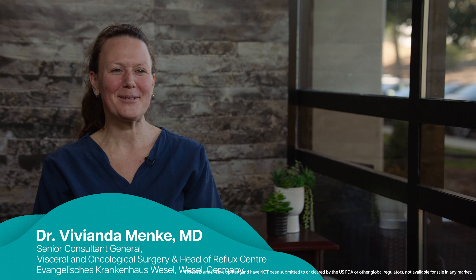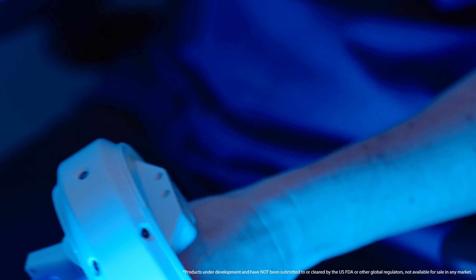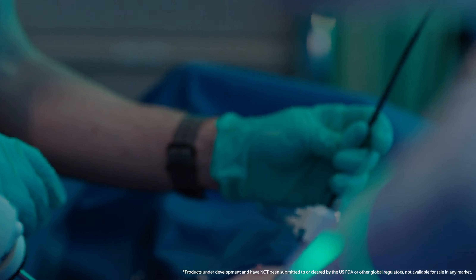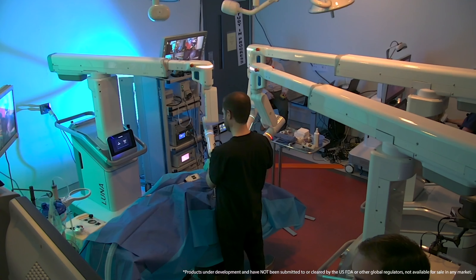When I explain surgery to a patient and say we're going to do it with a robotic system — it's more precise. If you turn your arm, you normally don't have a precise 360-degree movement, but with the robotic system you have a perfect 360-degree movement and the camera is standing perfectly still. It's a 3D system so you can see much better, you work more precisely, and you have less tissue damage. It's better for my hands because I'm not lifting the weight of a patient or doing an imprecise movement, and the patient benefits from that.